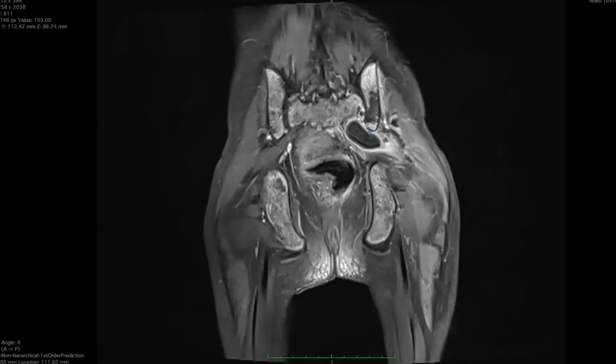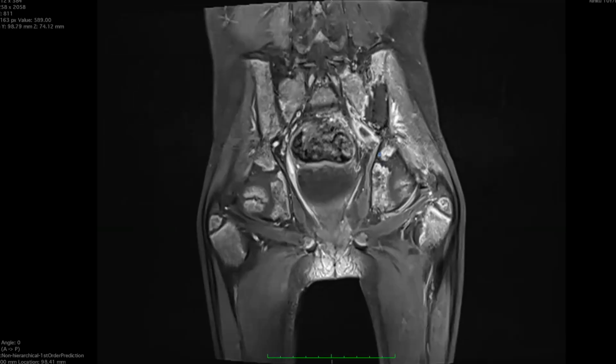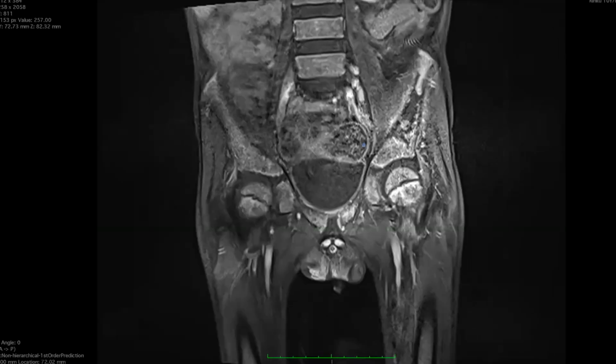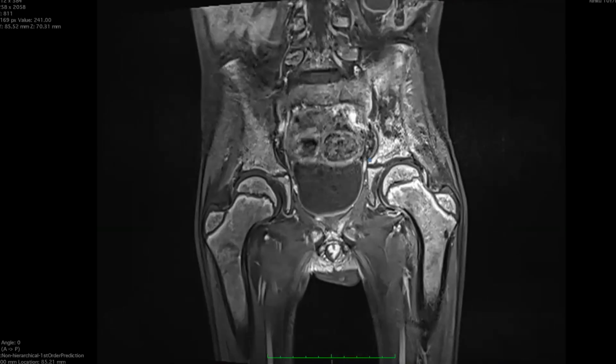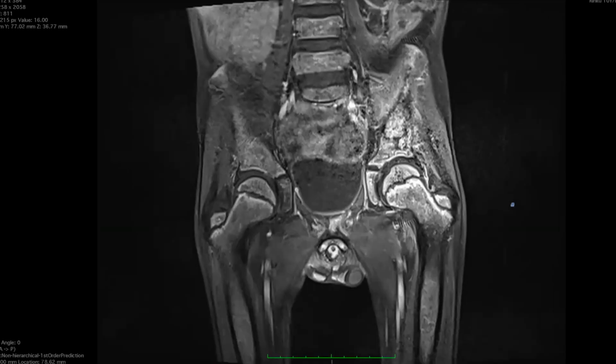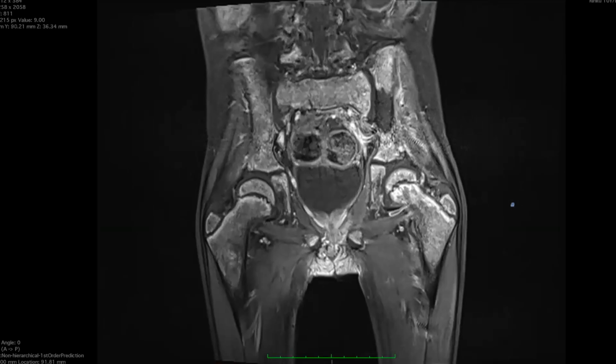And this was also a collection within the left piriformis muscle. This was showing dark signal on T2 or STIR, which showed blood products as well, because the patient had thrombocytopenia. Patient also had febrile neutropenia. So this is a typical FRCR type of a case where there'll be one major finding, and then there'll be small findings which are very, very clinically relevant.